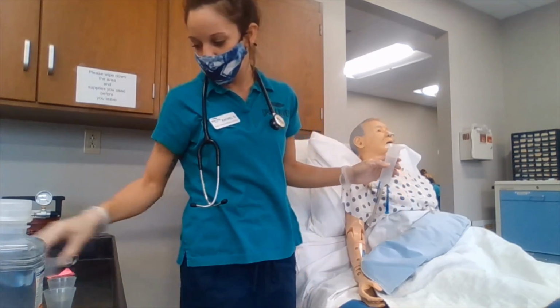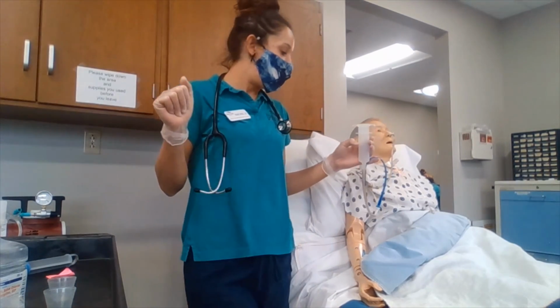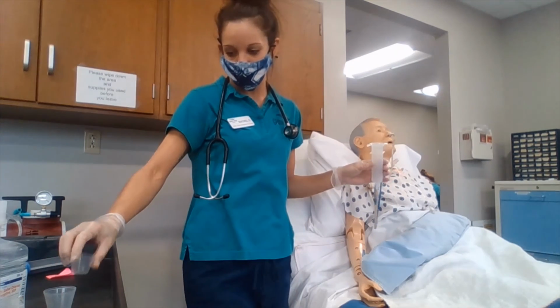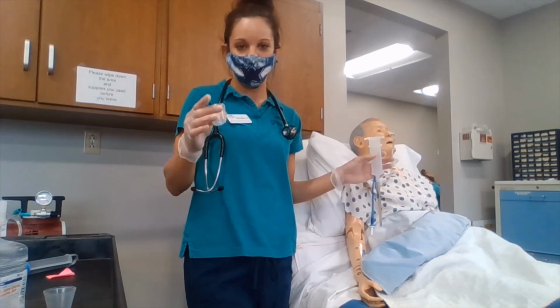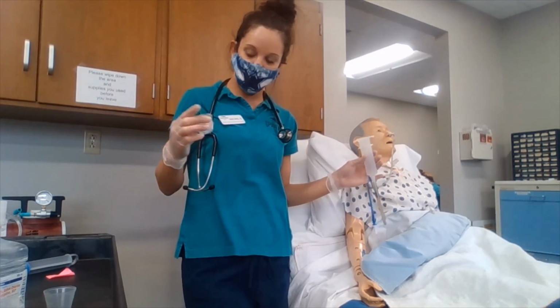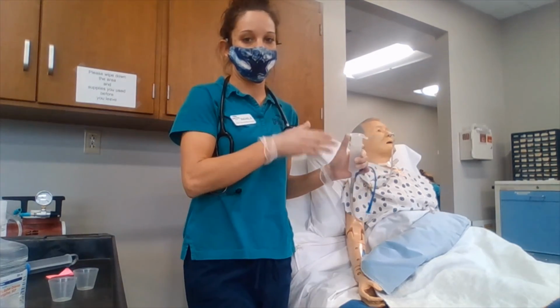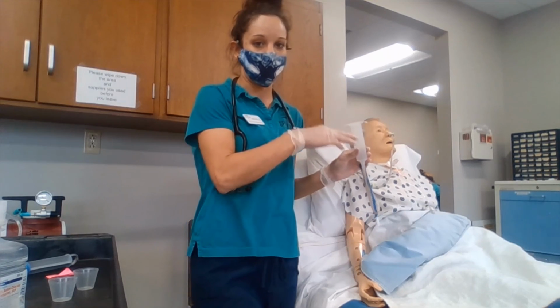After we are done with giving our first medication, we are going to then flush it again with 20 to 30 milliliters of water, and then we would give our next medication, flush it again, give our third medication, and make sure that we are flushing it when we are all finished up.